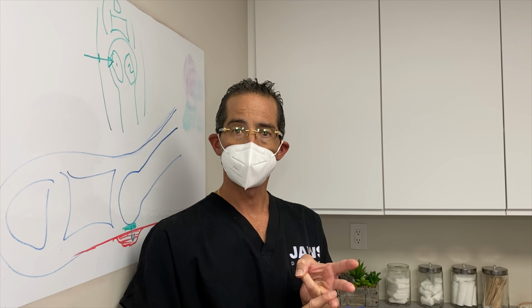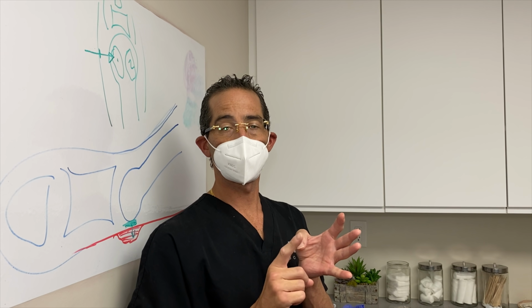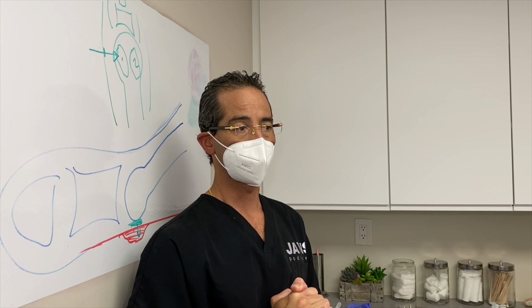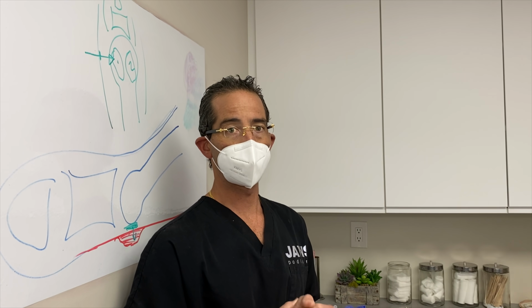Number 3, the curettes. And last but not least, we're going to have a callus shaver, something to really buff these calluses out. They're on back order. They're coming.